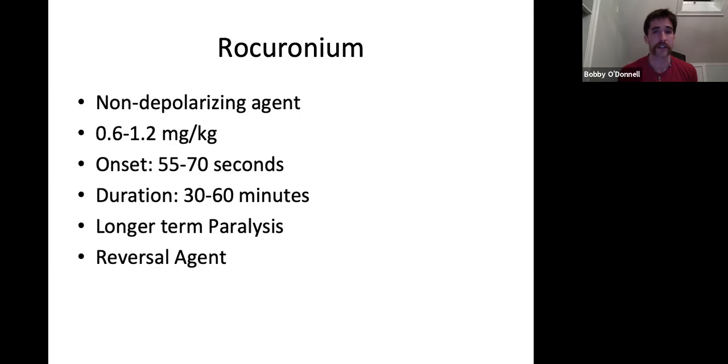It's not unreasonable to ask for a bolus of rocuronium that would get you to Lakes to Concord, Spear to Concord. With that, generally it'll last for about 45 minutes, and it will help make the patient tolerate the vent on the way for that transport till they can adjunct them to whatever pharmacological package, or realistically, they're going to change the mode of the ventilator in the ICU.